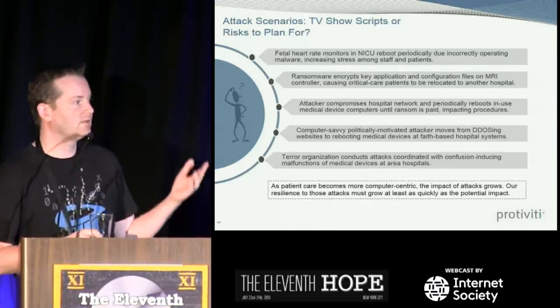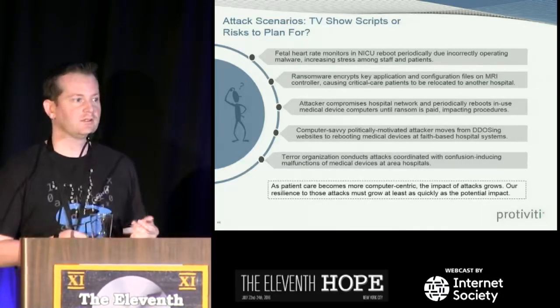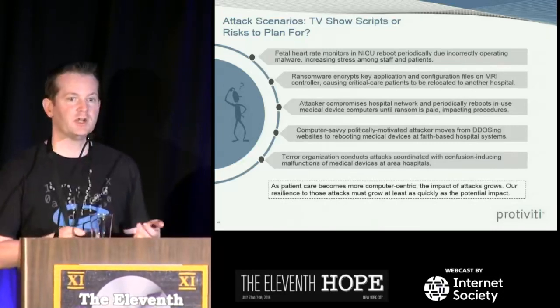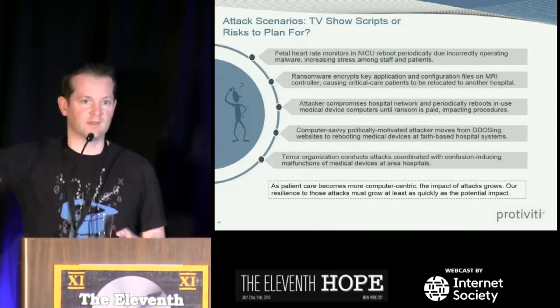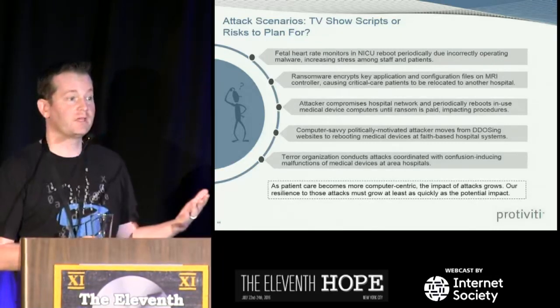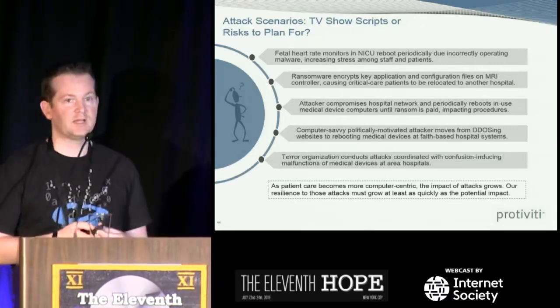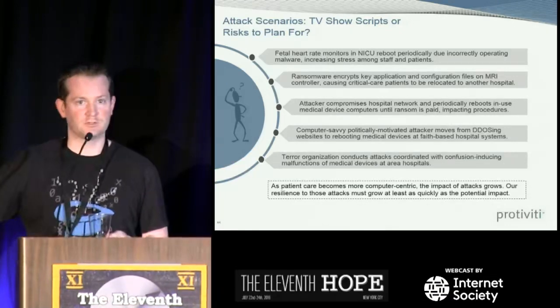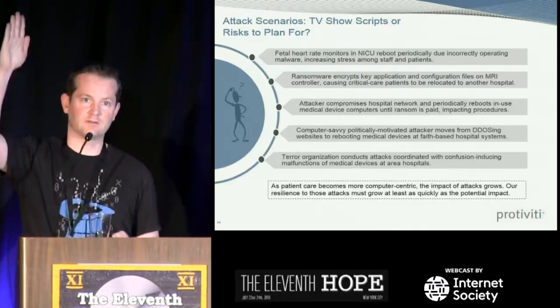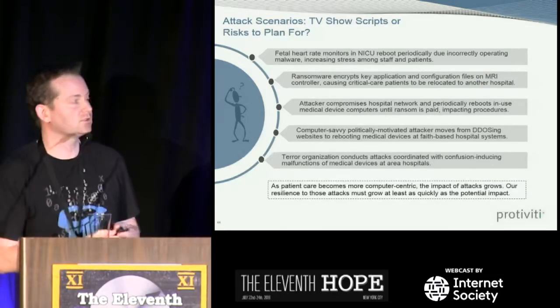And I think the important point here too is that we're increasing the use of technology and connectivity when providing patient care, right? It's going like this. We're ramping up all these new connected, cool devices that are improving patient care and enabling people to respond more quickly. At the same time, our security resilience posture should not be flat like this. If we're increasing our use and our dependency, we should also be increasing the security assurances.